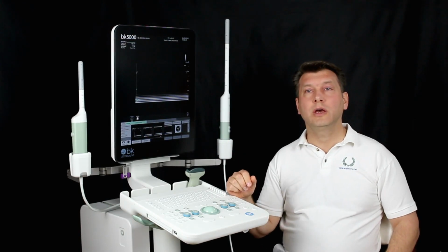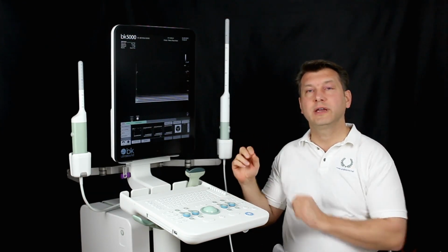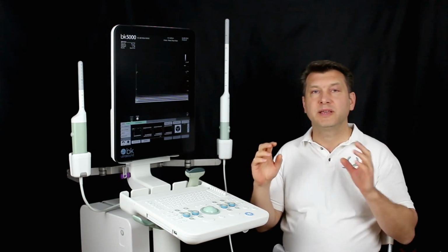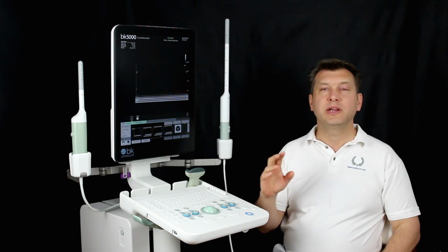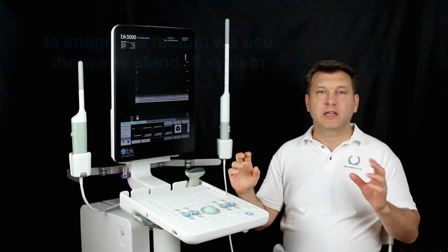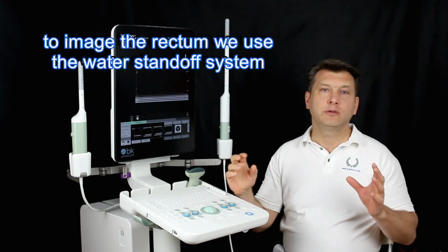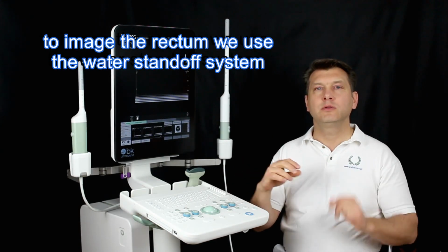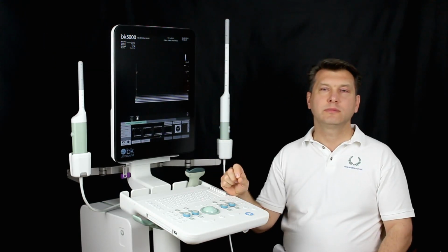In this video I show you how to perform rectal 3D sonography with BK 5000 and 3000. We should know that the settings are basically similar to those of anal canal sonography. A few parameters, however, are changed. Furthermore, for better coupling, balloon systems are used, which enable unopposed sound transmission from the probe to the tissue. The use of these balloon systems is explained in our separate videos.